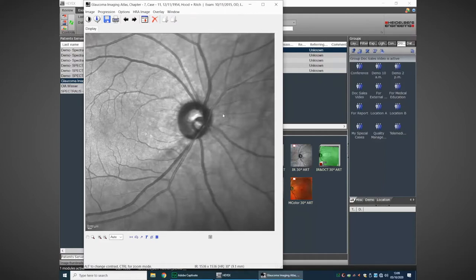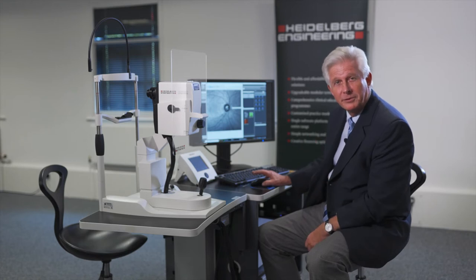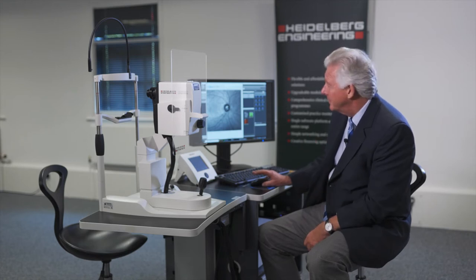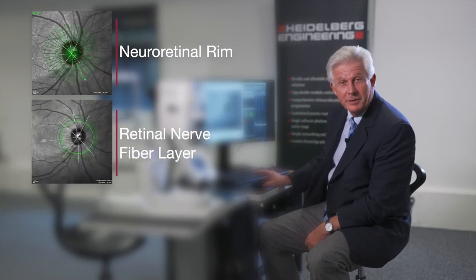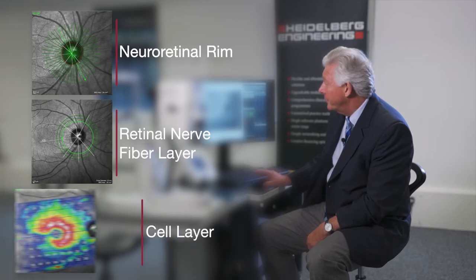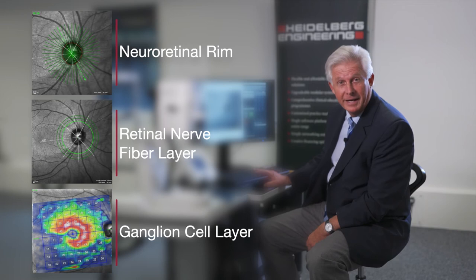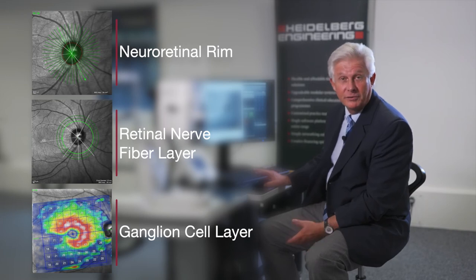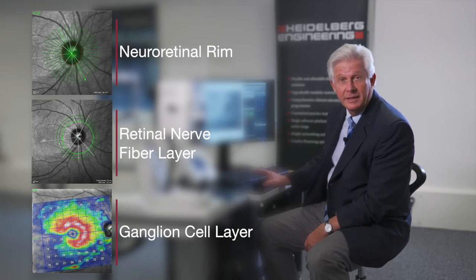We take a holistic approach to glaucoma and look systematically. Step one: we look at the neuroretinal rim. Step two: we move to the peripapillary nerve fibre layer. Finally, we follow the axons around and look at the ganglion cell layer, looking for notching of the ganglion cell layer across the horizontal midline, which is where we normally see changes relative to glaucoma.